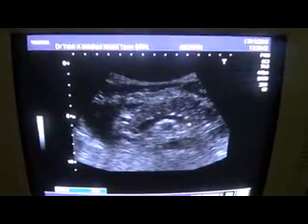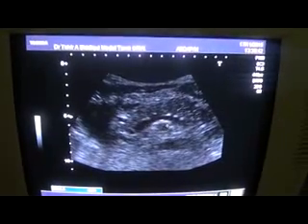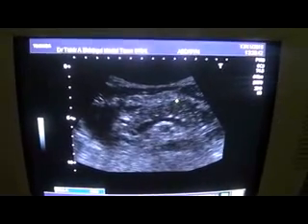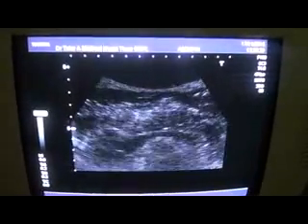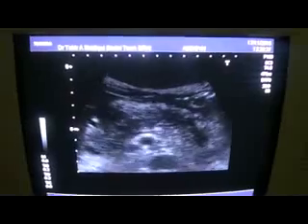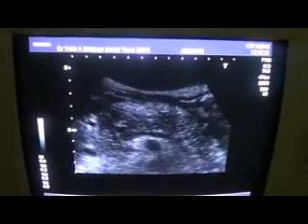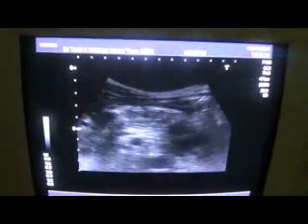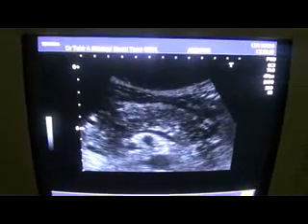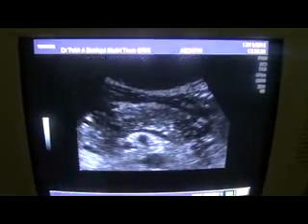And this is the splenic vein, the superior mesenteric vein, the superior mesenteric artery, the aorta. This pancreas shows diffuse decreased parenchymal echogenicity because of pancreatitis. I do not have any lab profile available, but when you don't have any profile, then we have to work like this.